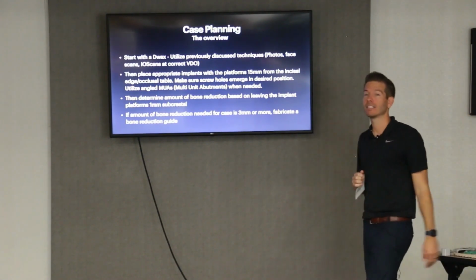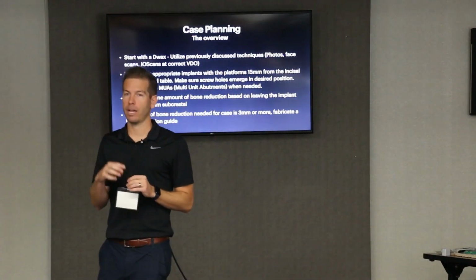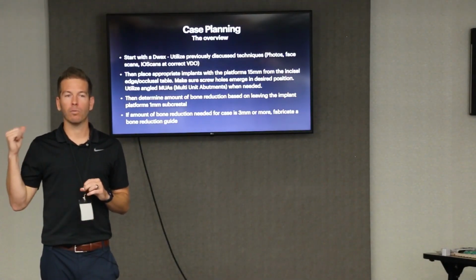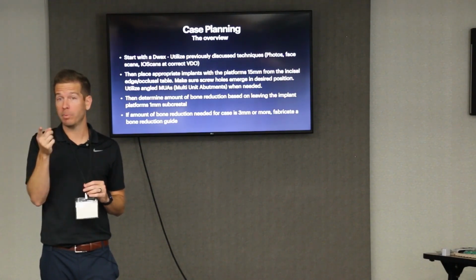Yes? So that made me think about how you take the scan of the patient to begin with. Correct. Occlusion or open occlusion. Yeah, it's a really good point. I've got a really good example of that in a couple slides that I'm going to show, exactly how I do that too, because you're right.